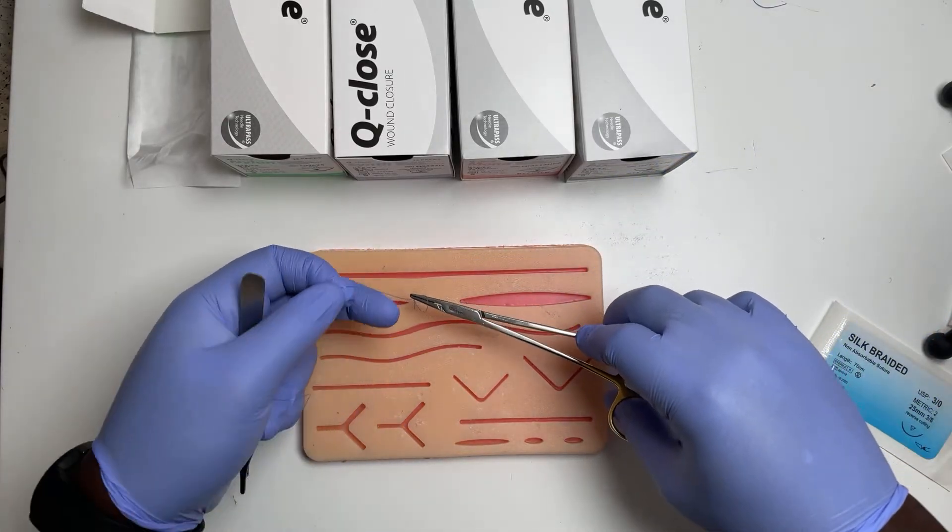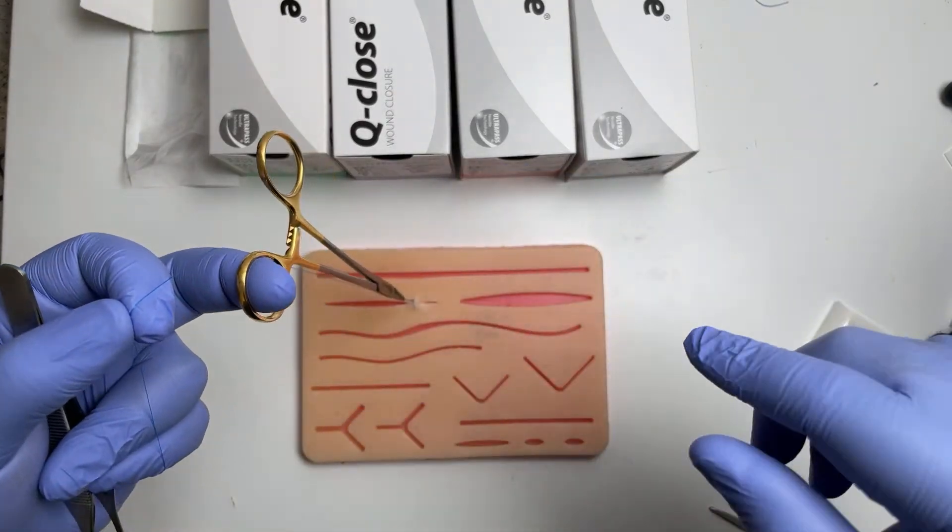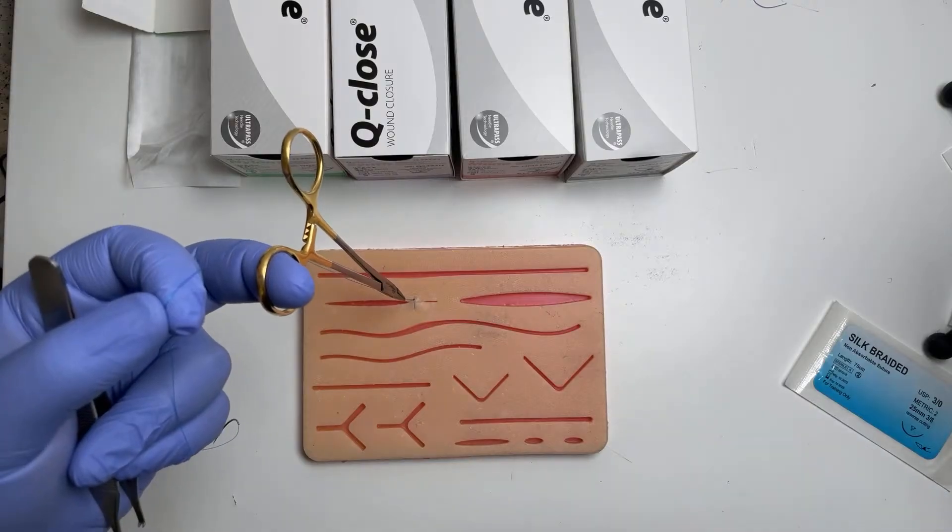It's a really gentle movement, and that's it. Slide down into one hand, everything into there, and then you can cut for yourself.